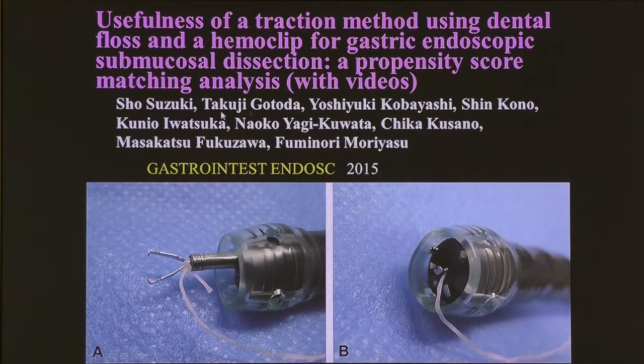So, in the case of the stomach, you put dental floss to the clip.